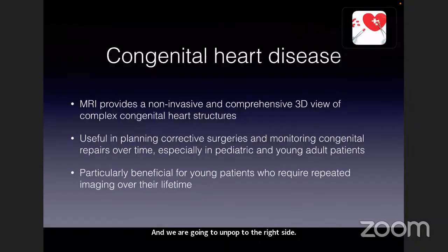Congenital heart disease. MRI provides a non-invasive and comprehensive 3D view of complex congenital heart structures, useful in planning corrective surgeries and monitoring congenital repairs over time, especially in pediatric and young adult patients. Particularly beneficial for young patients who require repeated imaging over their lifetime.